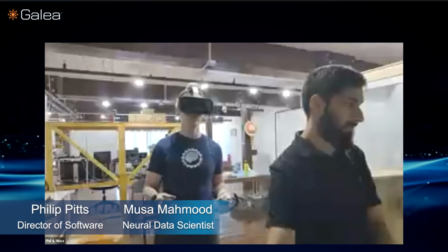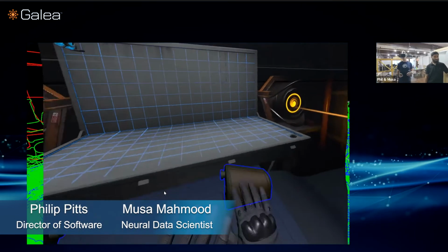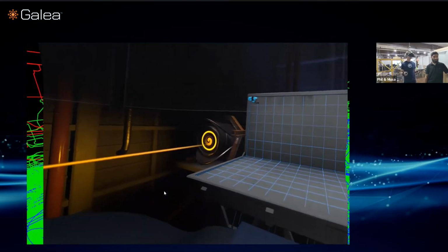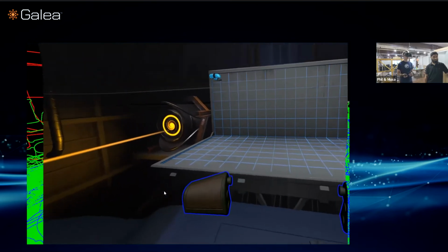All right. Well, thanks, Joe. What we're going to show you today is some new demo that we've built here in OpenBCI in-house. And this demo is showing off a couple of new features that we built into the Galea headset.